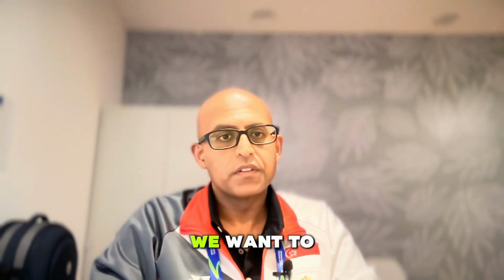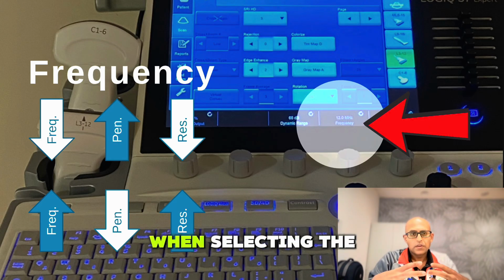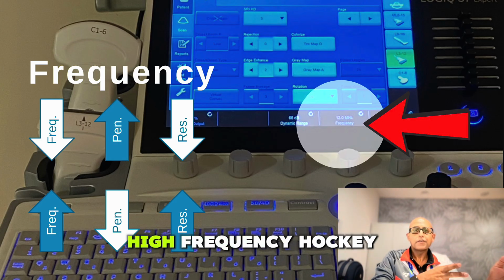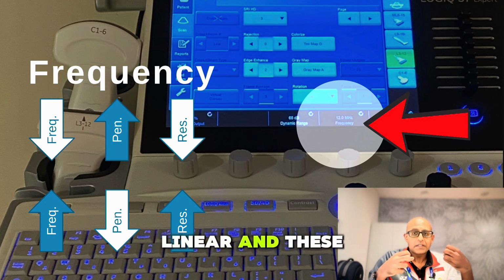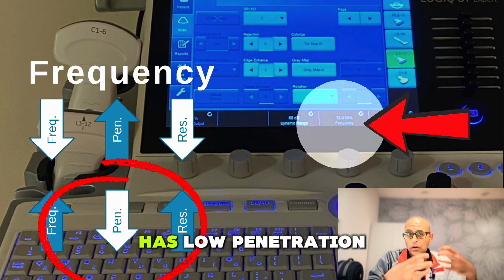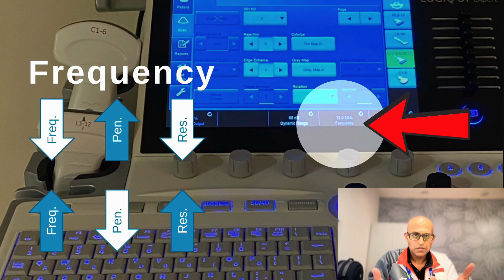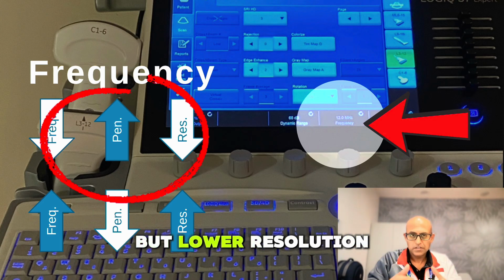The next function that we want to consider is the frequency. Now, as I mentioned earlier, when selecting the transducer, you have the high frequency hockey stick and the low frequency curvilinear. And these have different functions. So high frequency has low penetration but higher resolution, and low frequency has higher penetration but lower resolution.